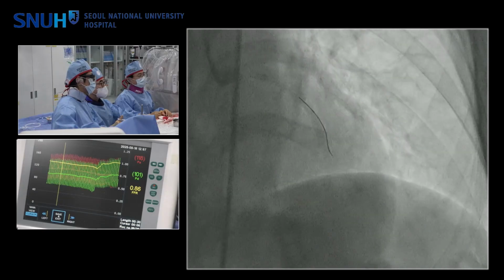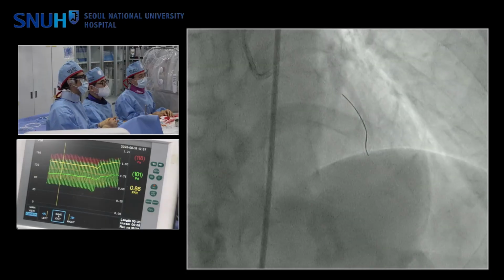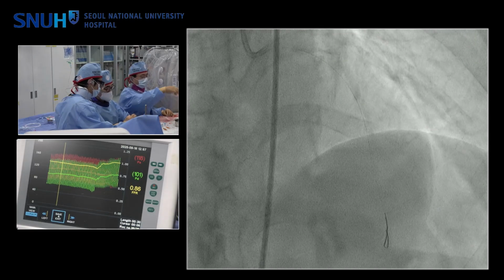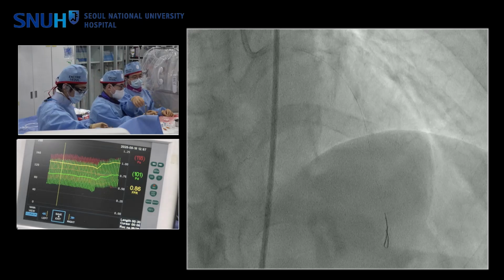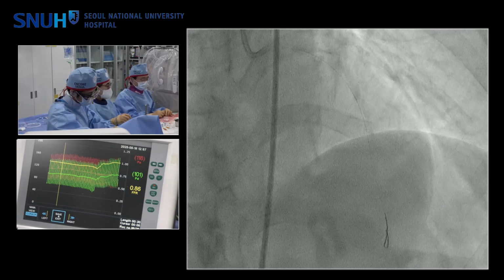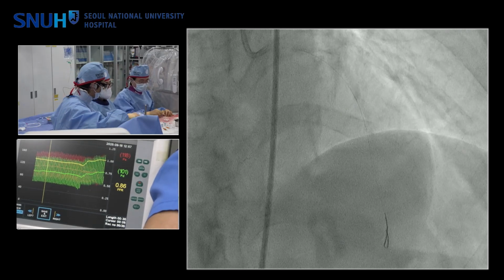Shall we test? Okay. IVUS, please. Because from the previous Korean study, we understand that treating left main, you must finish with the IVUS, because otherwise there will be a lot of unrecognized stent deformation or problems or issues, right? And that is associated with a high event rate.